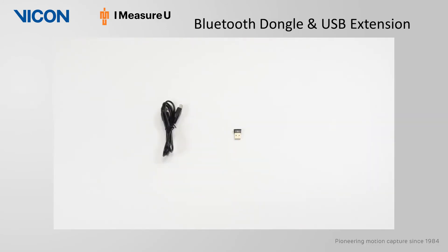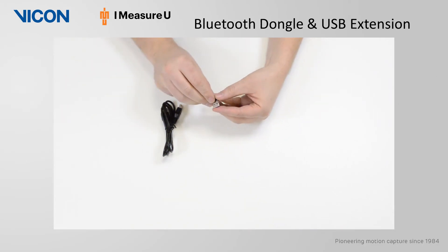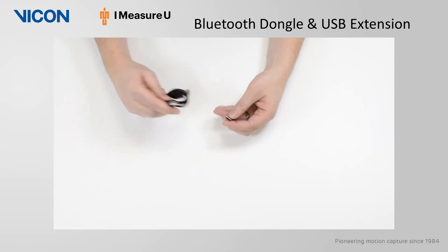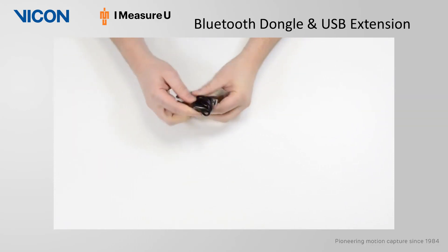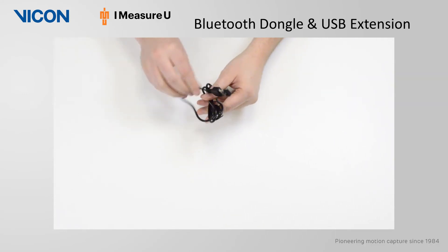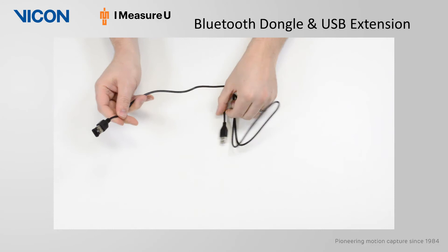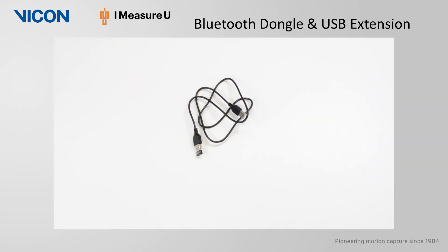Here we have the Bluetooth USB adapter and USB extension cable. iMeasureU uses Bluetooth Low Energy. The BLE connection means that the sensors have a fantastic battery life, whether you are collecting data in the lab or have a subject completing a full marathon. Bluetooth connectivity gives you the ability to connect to your lab software Nexus, or directly to your smartphone and tablets.